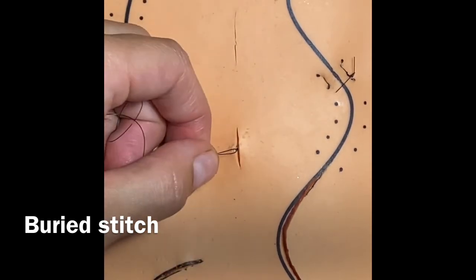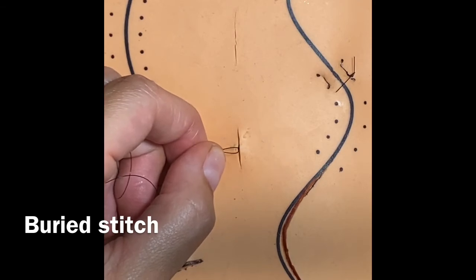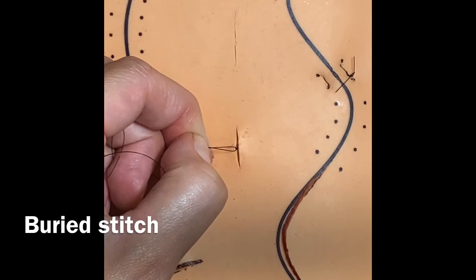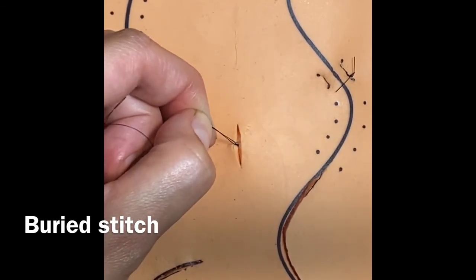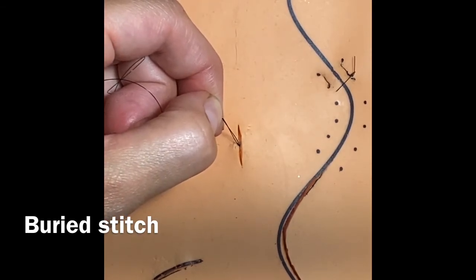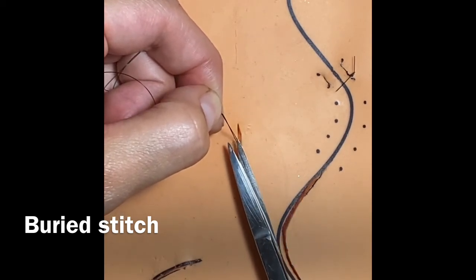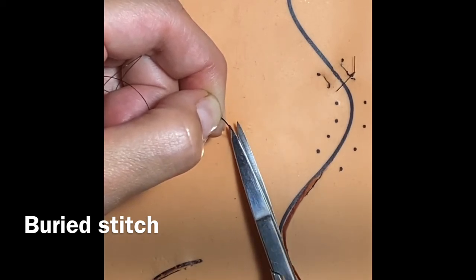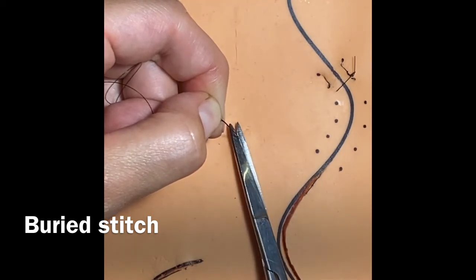Any surgical wound where you need to cut the tails, it's a little bit different than how we've shown you how to cut tails on the other sutures that are outside the skin surface. This, we don't want the tails sticking out. So the proper way to cut this, and when you're a student, you'll often be cutting for surgeons or other PAs or residents, is open your scissor a little bit. You want to kind of slide down the suture line here, the tails. When you feel the knot at the bottom, you turn your scissors 45 degrees and then cut.